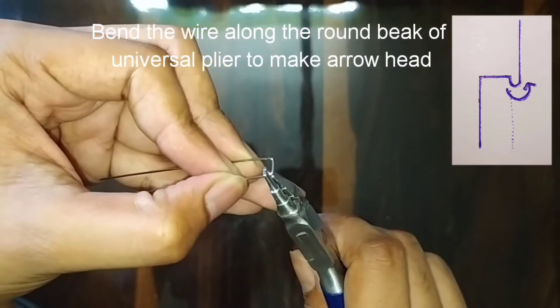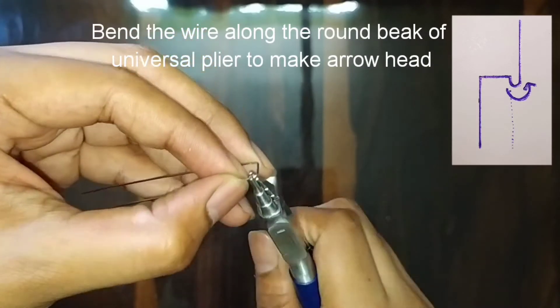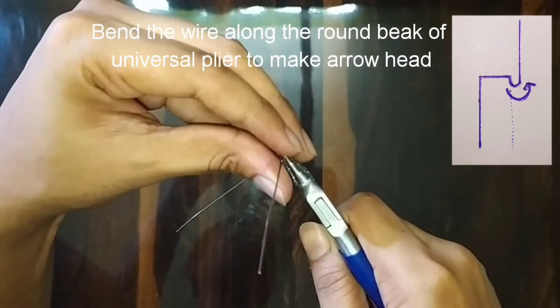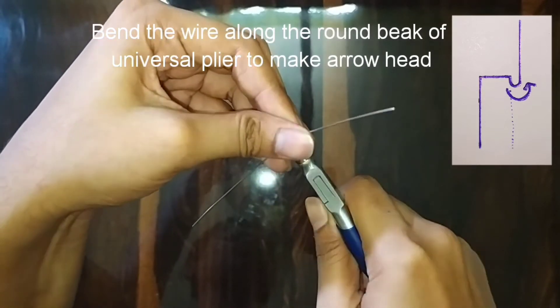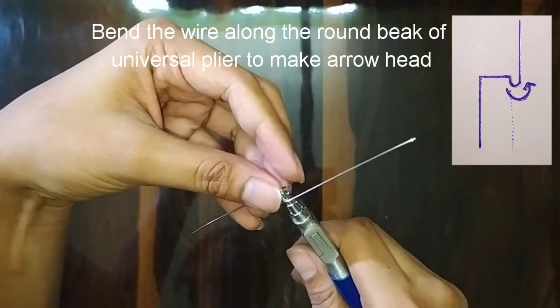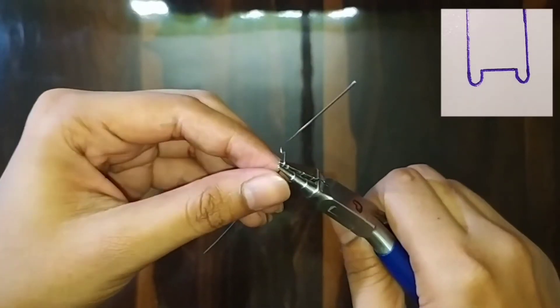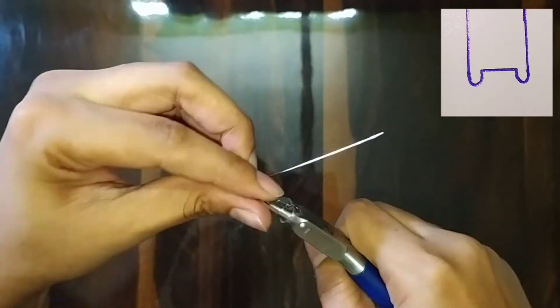Now with the help of the universal plier, we will make the arrowheads. Hold the wire with the tip of the plier tightly and roll the wire along the round beak of the plier. Do similarly on the other side too.